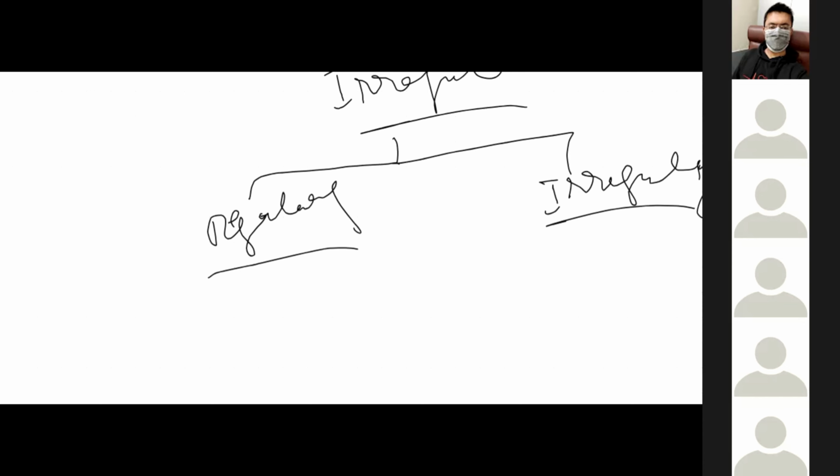As we discussed, lead 1. Now, as we said, this is an isoelectric line. Upward deflection is called positive deflection, downward deflection is called negative deflection.